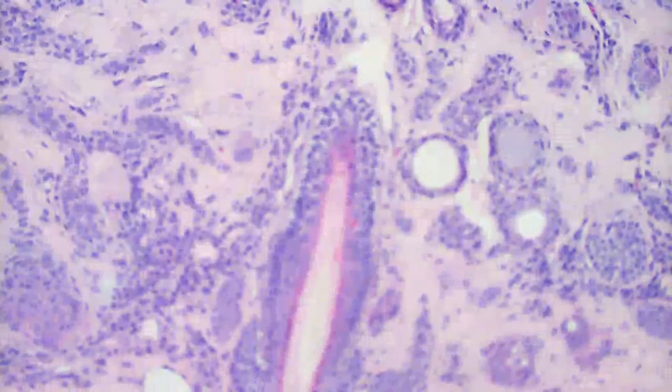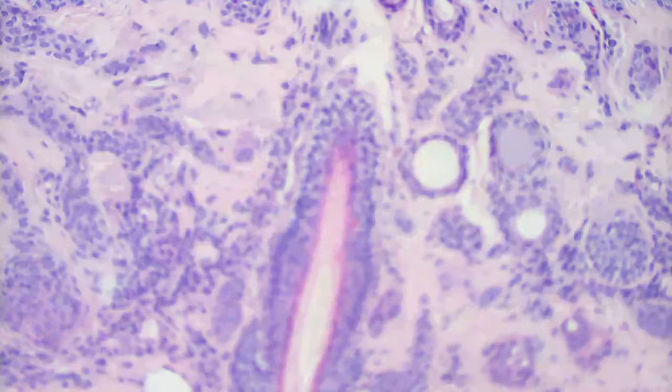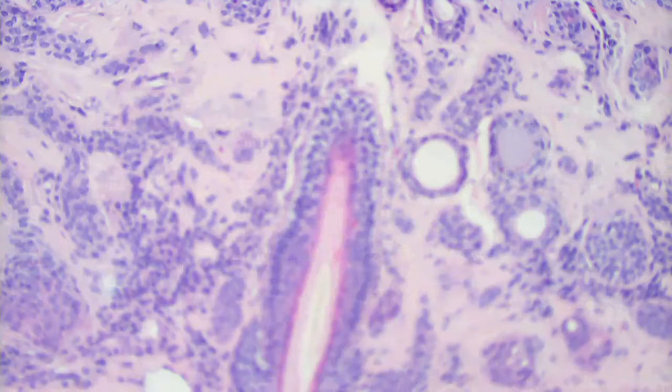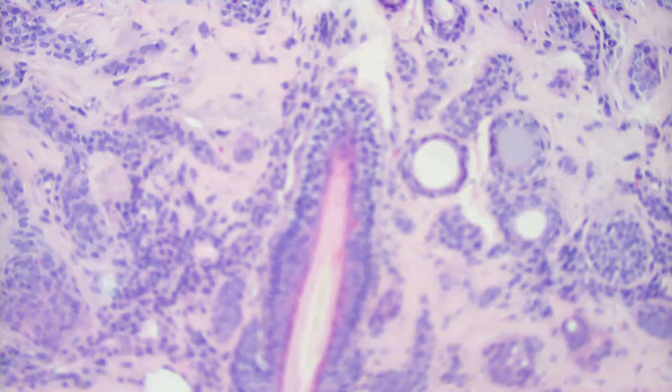Now, there's two settings of syringoma. There's obviously the ones that are most common around the eyelids, like this. And then there's another type that can be eruptive that can occur in the groin area, the chest area, the suprapubic area. So those are other variations that you see, the so-called eruptive type. They can be seen in patients that have Down syndrome. So that's something to remember. Boards like to ask that kind of question. And so basically it looks pretty straightforward as you saw right there.